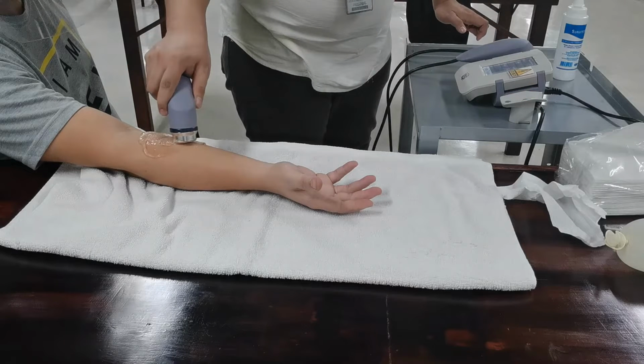So after you have input the time or duration on the machine, once the ultrasound head is in contact with the patient's skin, the treatment will start. When the ultrasound head touches the patient's skin, the light goes off, which means the treatment has started.